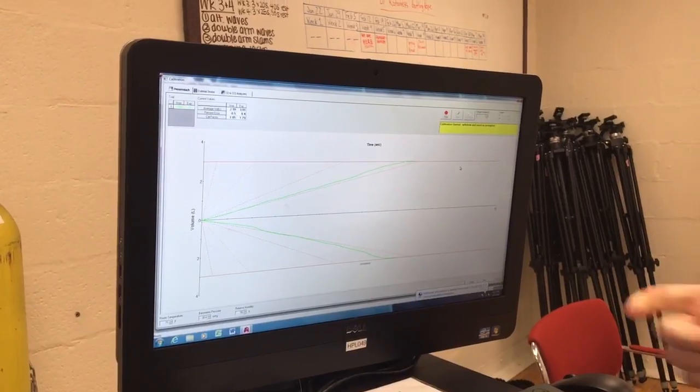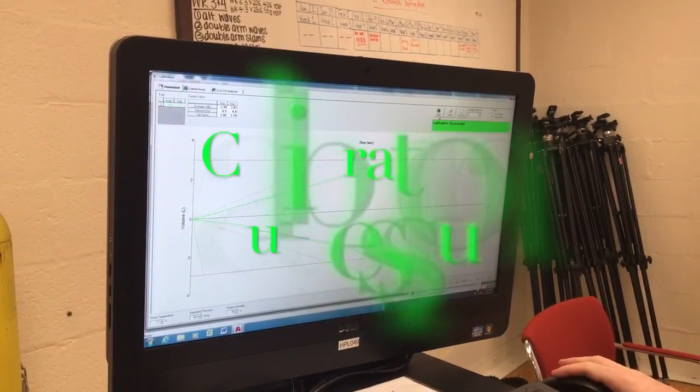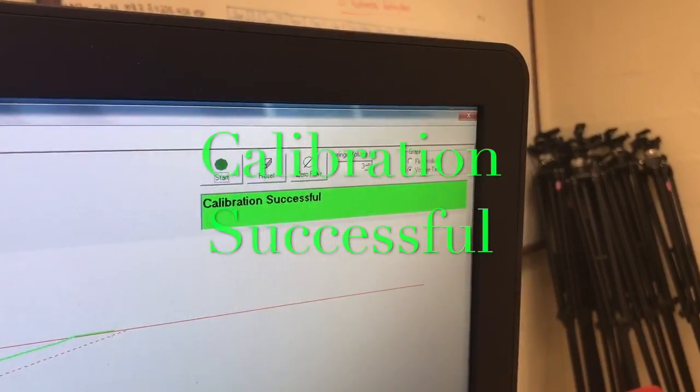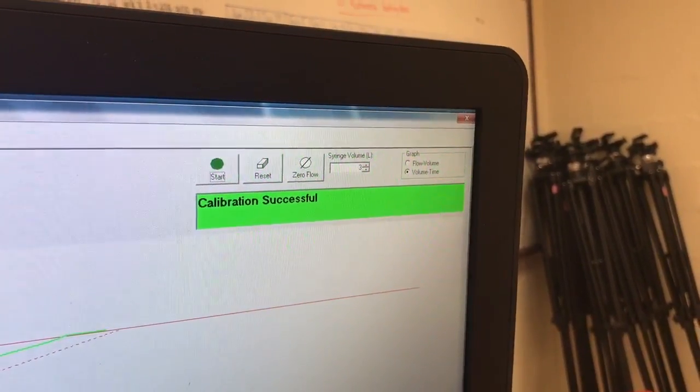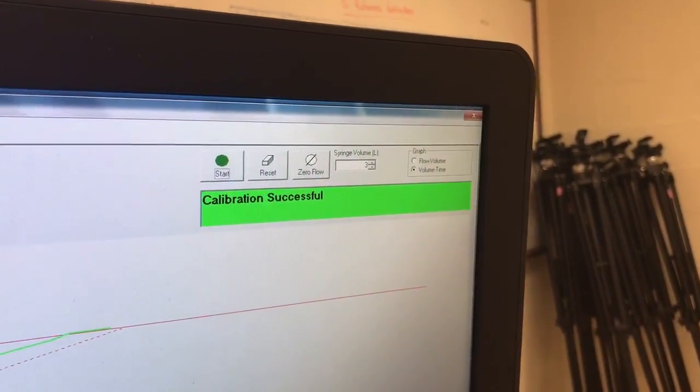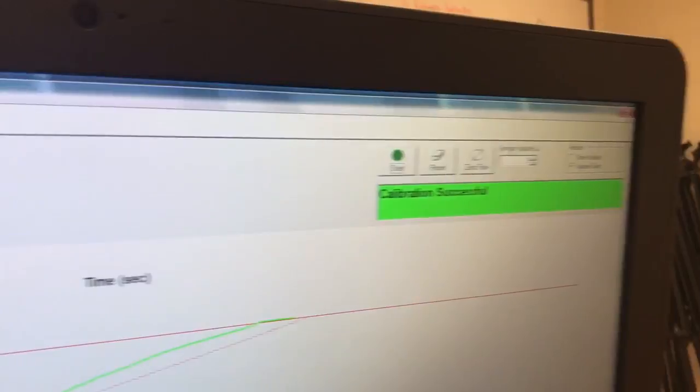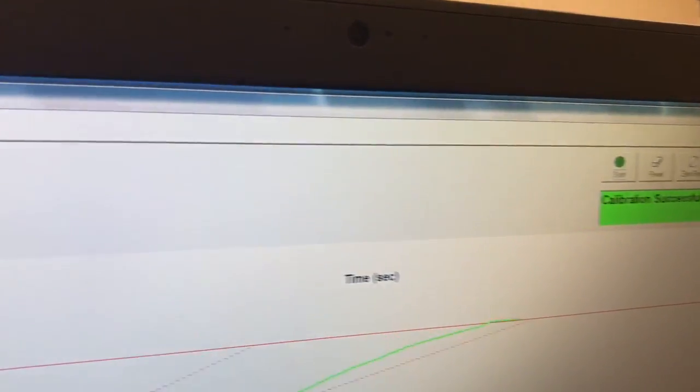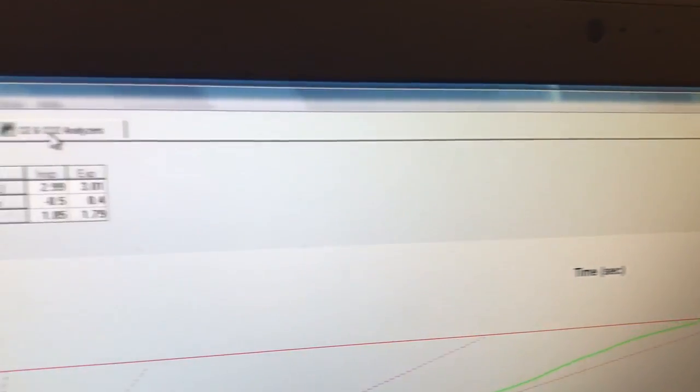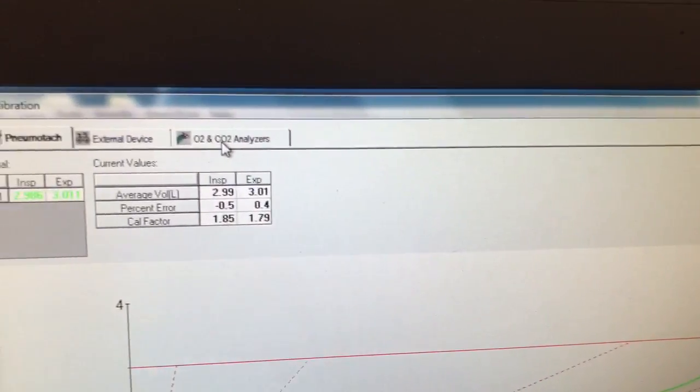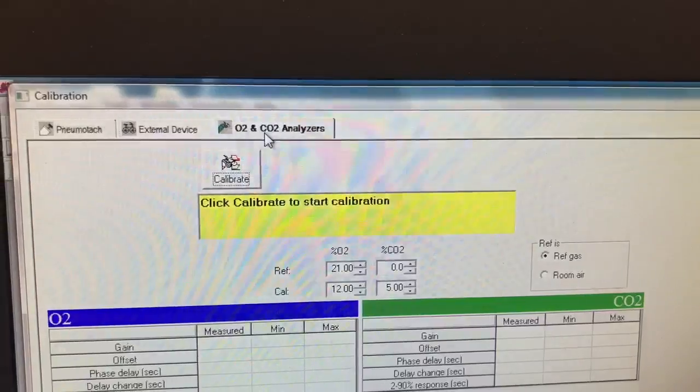After you have a successful calibration, select the O2 and CO2 analyzer tab and hit calibrate.